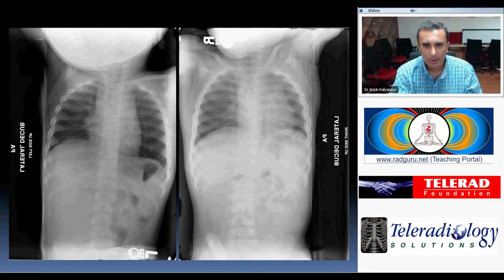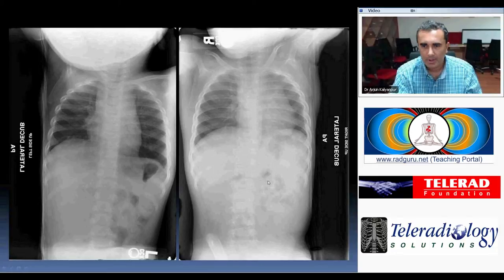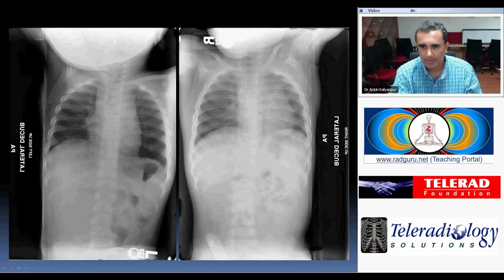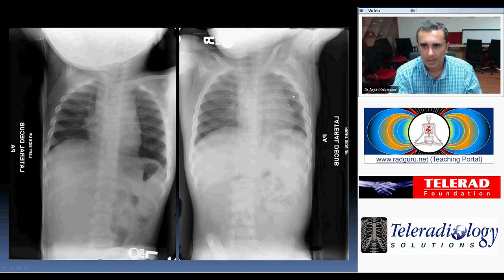Here is an example of two such radiographs. Looking at the one to our right, this is a right side up decubitus radiograph, meaning the patient is lying left side down. As we would expect, the mediastinum is shifted over to the left, which indicates that normal physiology is applicable and the lung is normally decompressing under the weight of the mediastinal structures.